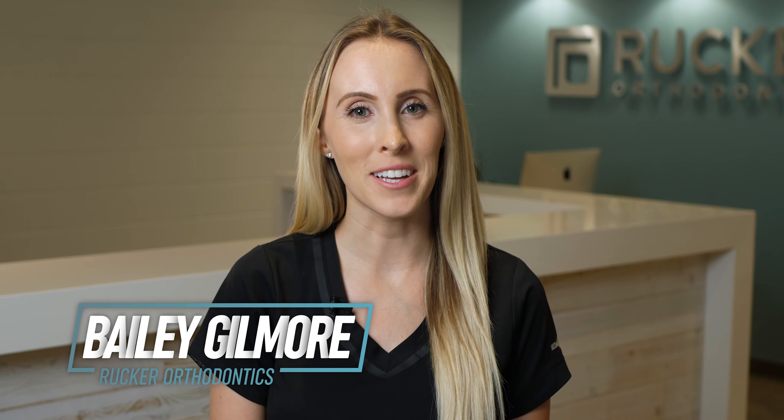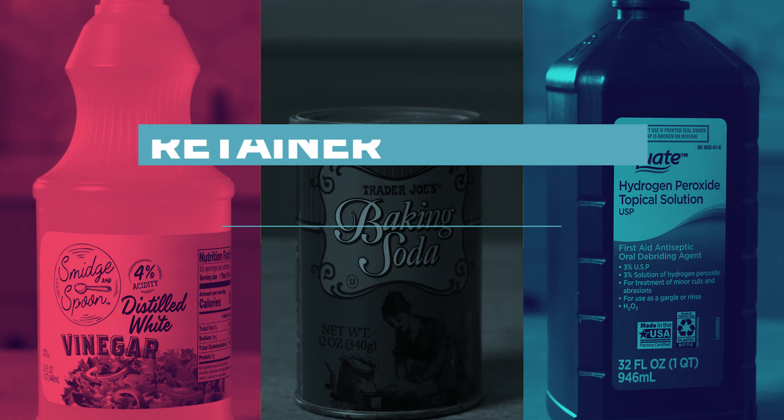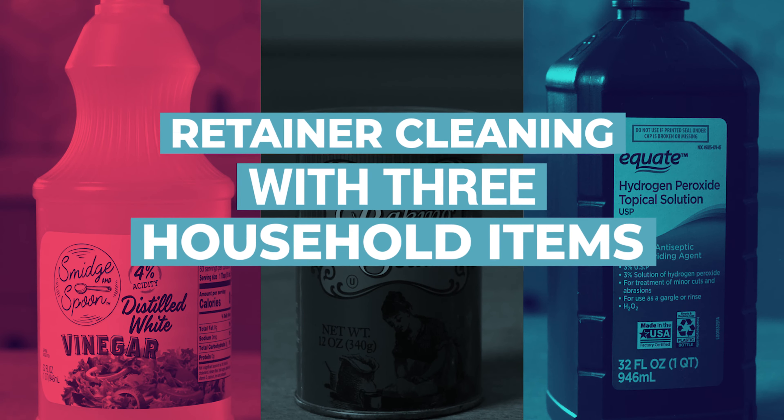Hi, I'm Bailey with Rucker Orthodontics. I'm going to show you three ways to clean your retainers and clear aligners such as Invisalign. We like these solutions because you probably already have the products in your home.